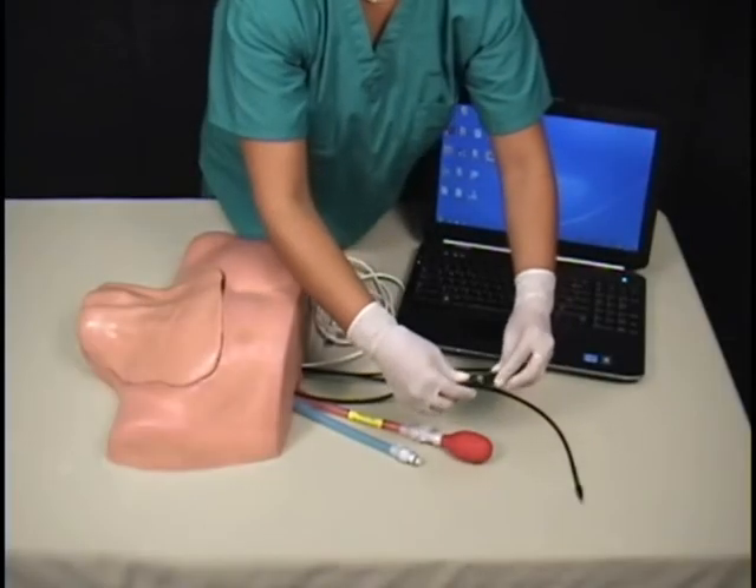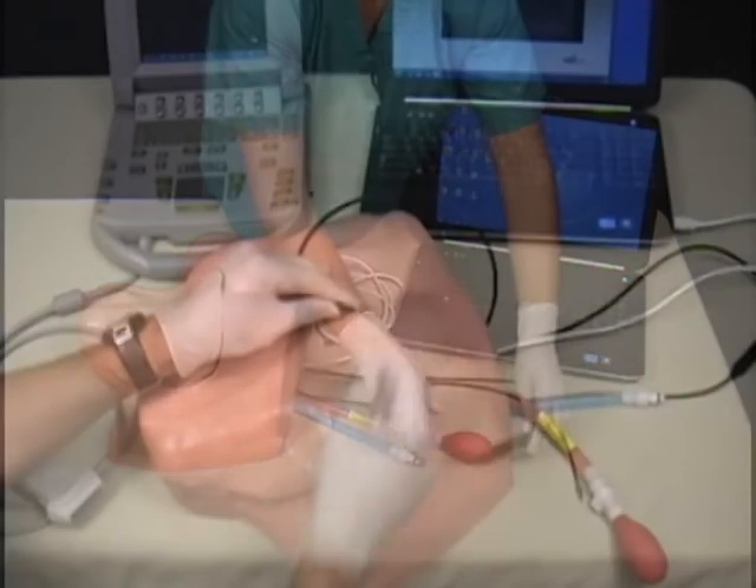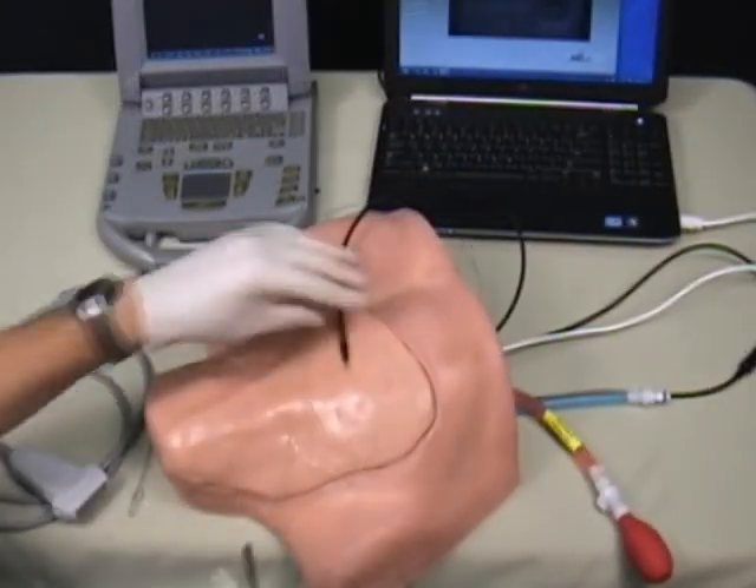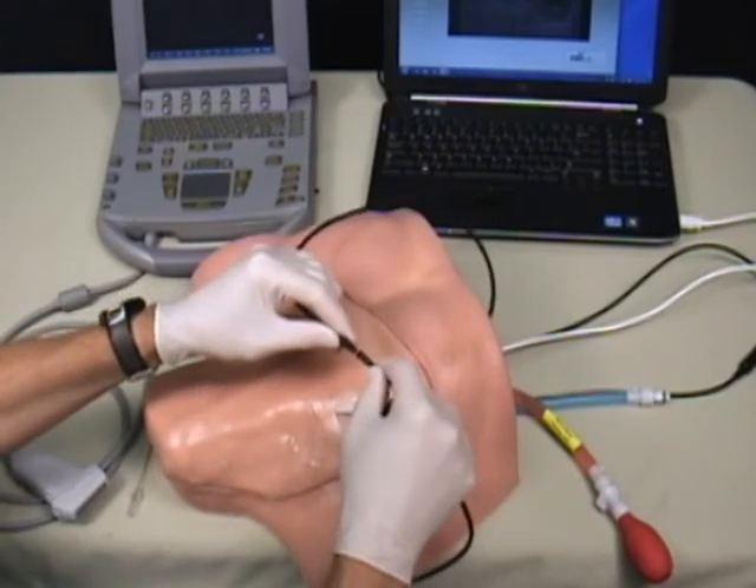The Interscalene Supraclavicular Block Trainer is easy to set up and includes a sample conjunct nerve stimulator needle and a universal needle adapter so that any needle can be used with the system.